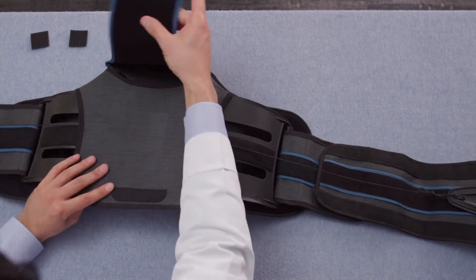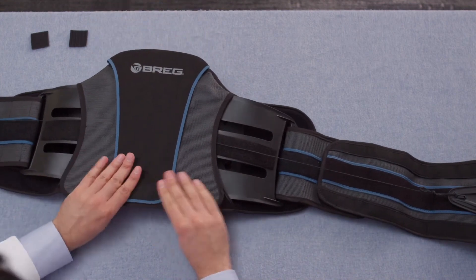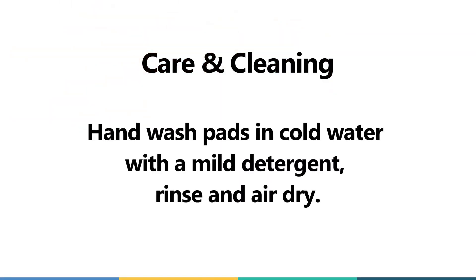Now you've successfully installed the extension panels to the Pinnacle waist belt. Hand wash pads in cold water with a mild detergent. Rinse and air dry.